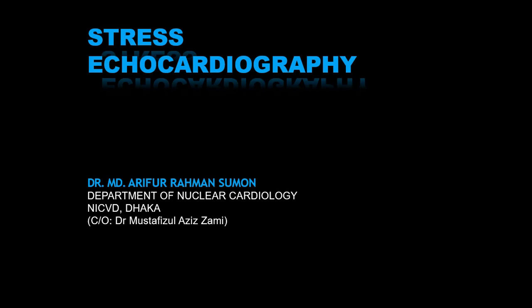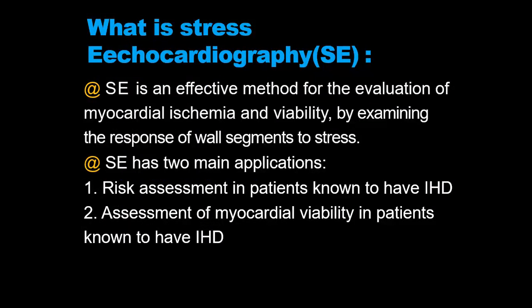Stress echocardiography. So what is stress echocardiography? Stress echocardiography is an effective method for the evaluation of myocardial ischemia and viability by examining the response of wall segments to stress. Stress echocardiography has two main applications: risk assessment in patients known to have ischemic heart disease, and assessment of myocardial viability in patients known to have IHD.